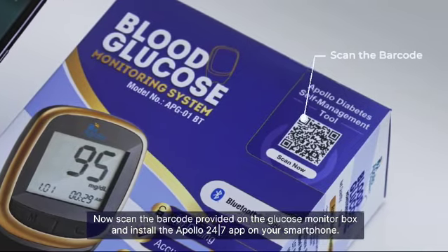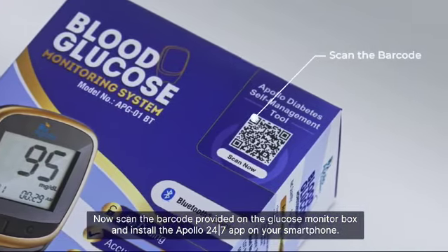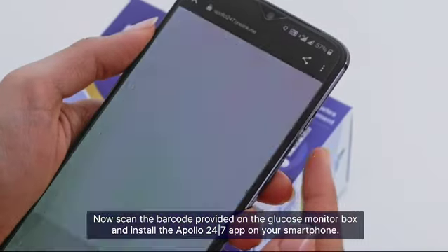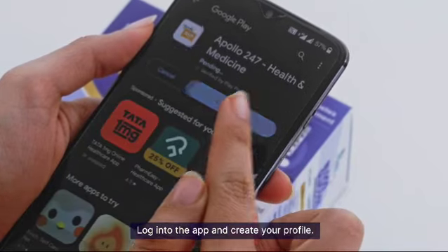Now scan the barcode provided on the glucose monitor box and install the Apollo 24/7 app on your smartphone. Login to the app and create your profile.